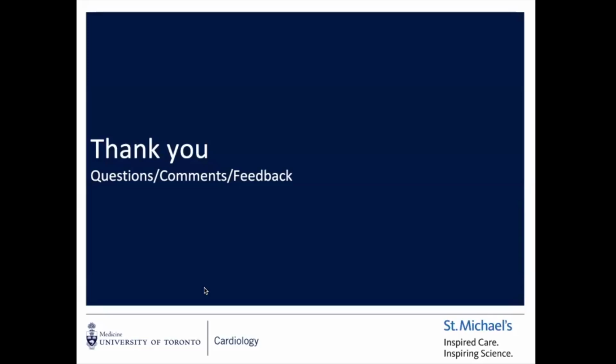The RV focus view was introduced by that paper, and thanks to our Canadian contribution, we were able to do that. He also involved another epidemiologist from the Jewish General to look at all the cutoffs. The problem with the right heart at the time it was published was that there were not a lot of papers on normal values. So it still remains quite a challenge.